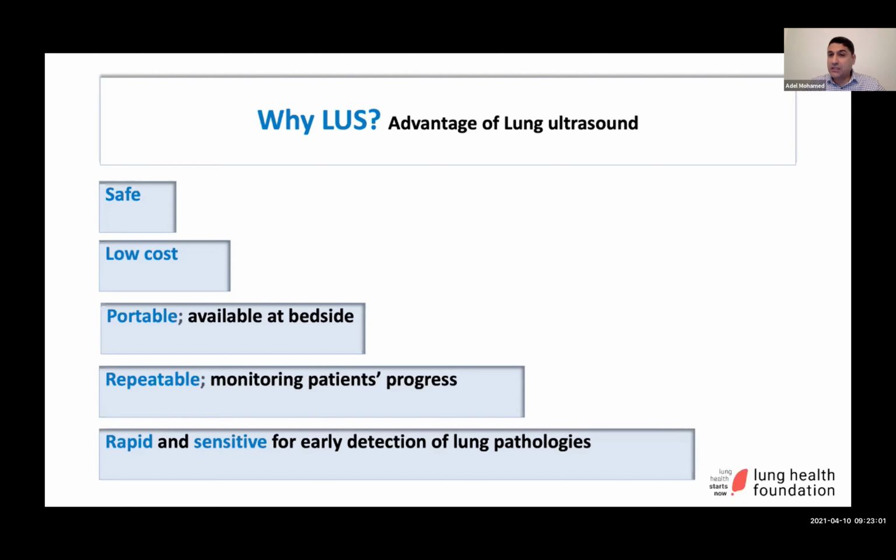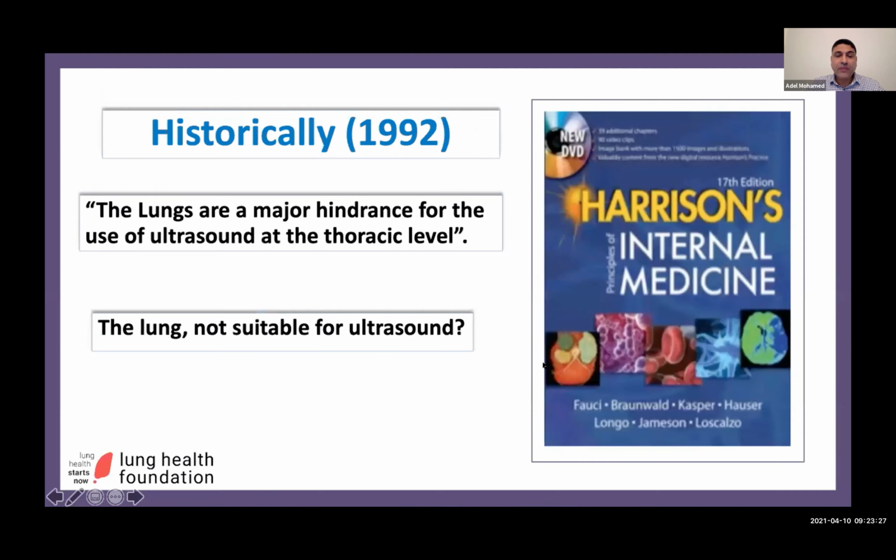It is a rapid test. Once you learn lung ultrasound, it usually takes 2 to 3 minutes. And I'm not exaggerating, 2 to 3 minutes for you to finish scanning the right and left lung, unless you do extra diaphragmatic assessment or upper airway, which is not counted in these 2 to 3 minutes. It is also a very sensitive tool for early detection of different lung diseases.